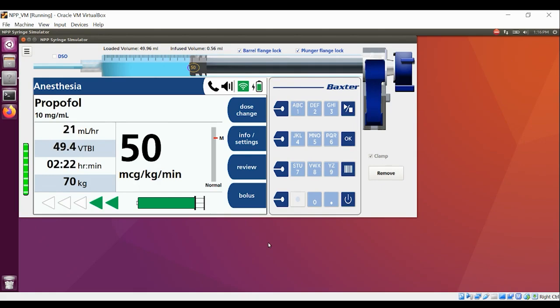If you're going to deliver a bolus, the rapid bolus is what primarily they would be interested in. So again, let's make it 50 micrograms and be sure that you have that high flow set on just to make sure there's no issues with downstream occlusion alarms.